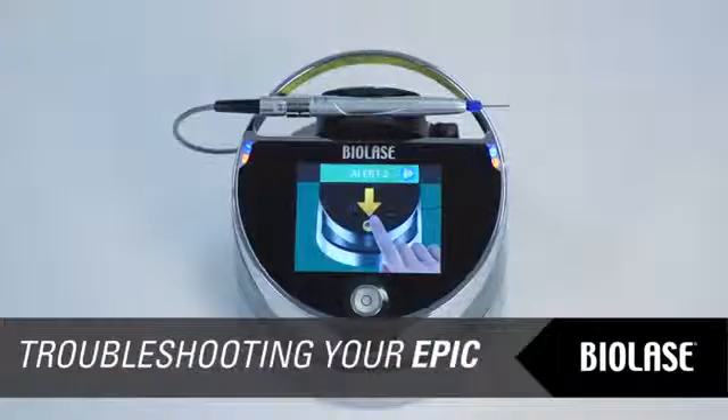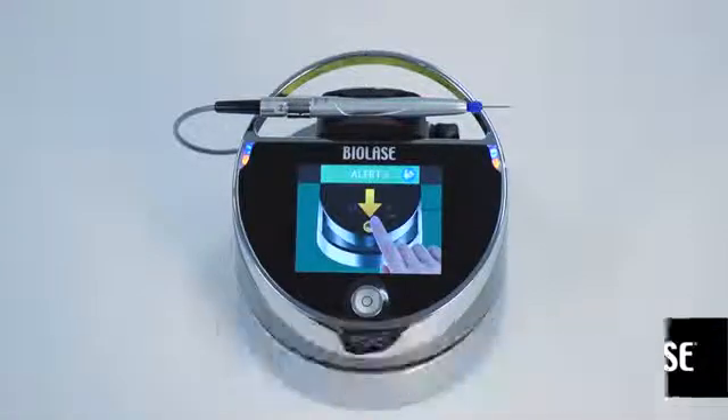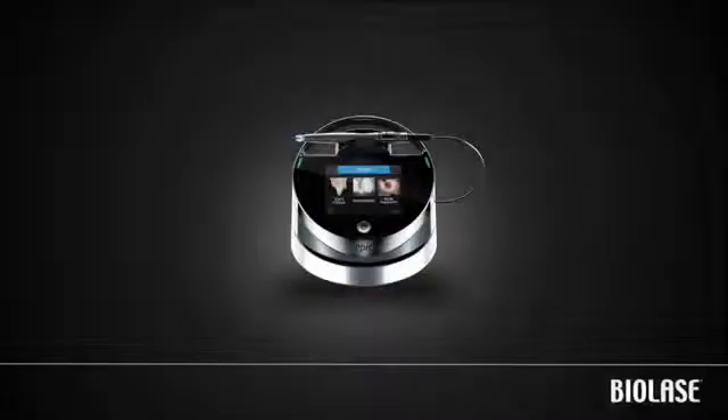From time to time, your EPIC system may display an alert, caution, or warning message on the touch screen. For a complete list of possible messages and steps to resolve them, please refer to the EPIC user manual or quick setup guide. You are now ready to begin using your EPIC.